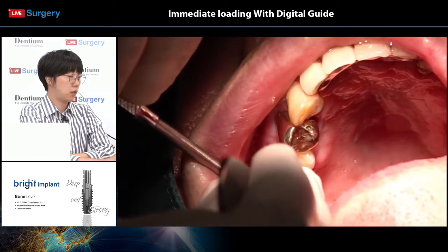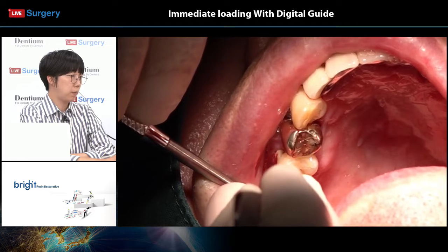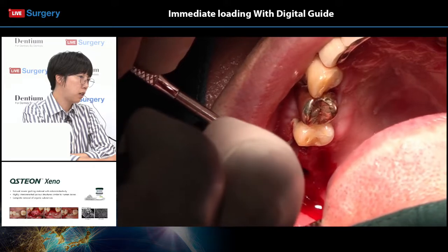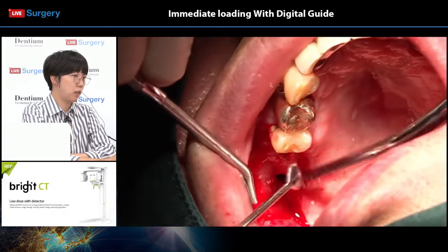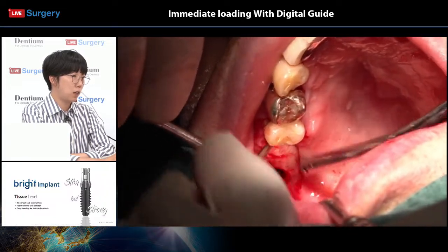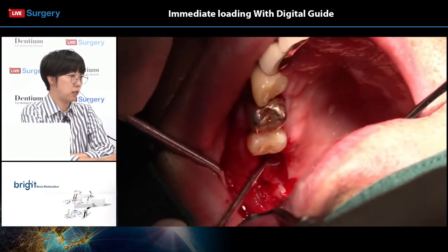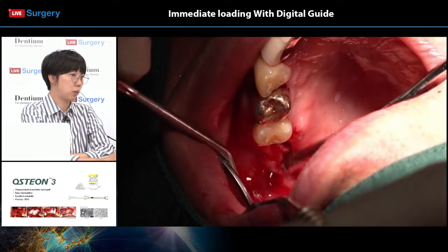And Dr. Lee has positioned the implants and is now reflecting the flap. He could have done this before actual implant drilling, but I think the reason that he is reflecting the flap now is that the guide was okay, so he placed the implants first, but there isn't enough keratinized tissue on the buccal side, so I think he will reflect this flap and position it in a way that an apically positioned flap surgery is done, to make sure that the patient has enough keratinized gingiva when the surgical site is healed.